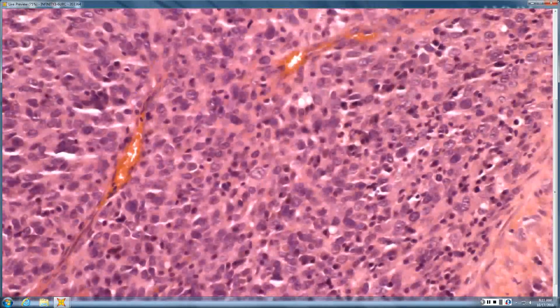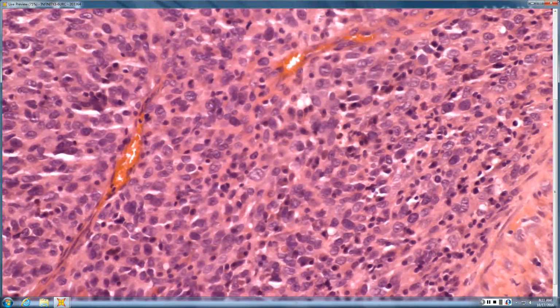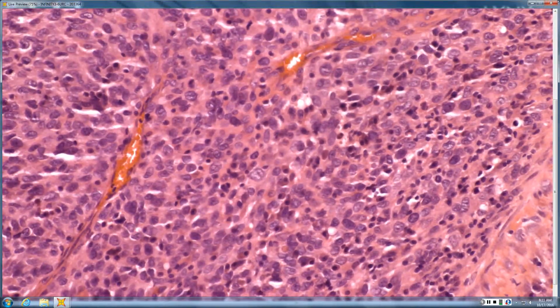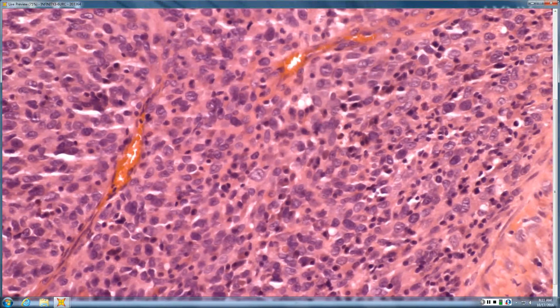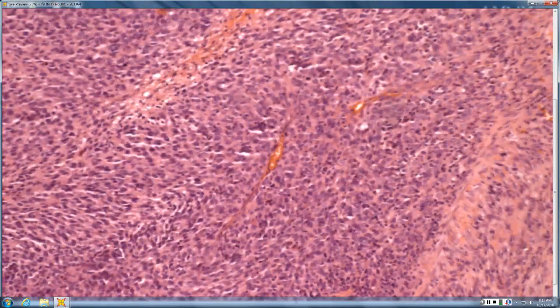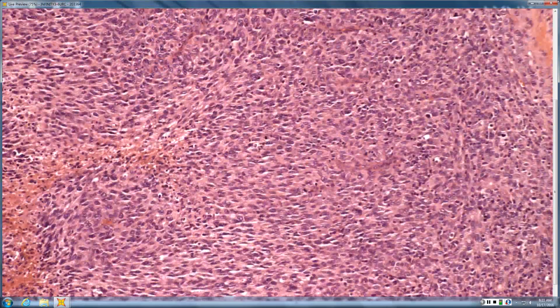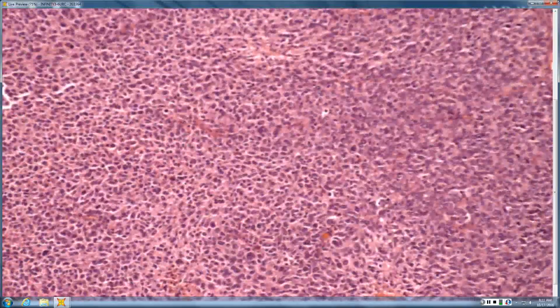That's not as good as some, but you can make out a little bit that the nucleus is on one side and you have pink cytoplasm next to it. That's what's referred to as a rhabdoid appearance, like a rhabdomyoblast, where you've got an eccentric nucleus and a blob of pink cytoplasm next to it. So a little bit of rhabdoid morphology, sheets of highly malignant cells. Myosarcoma? Yeah, actually that's a common pattern for melanoma, to look rhabdoid like that when it's metastatic. So just a huge nodule of melanoma.